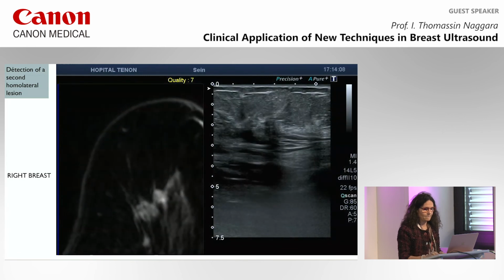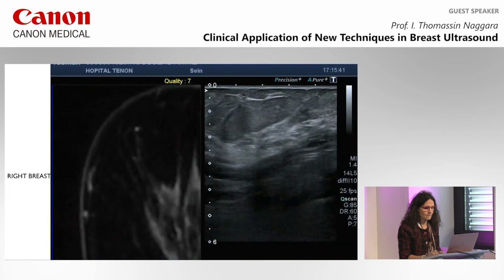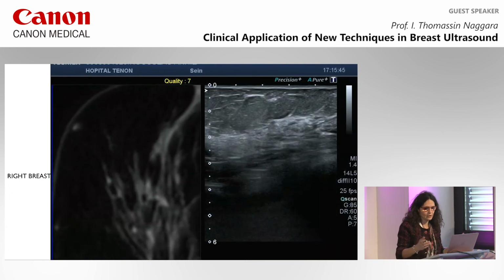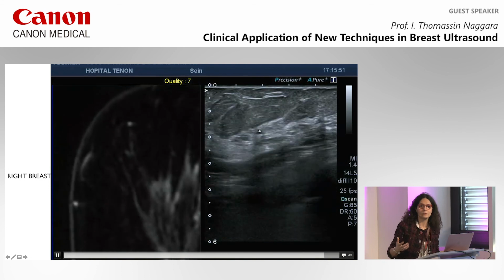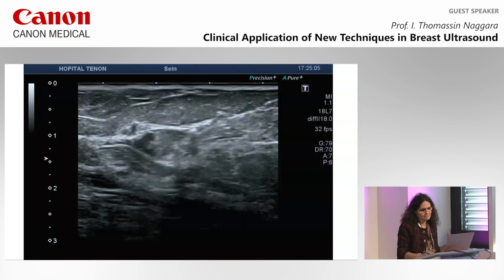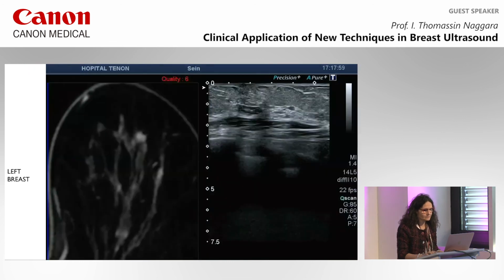Here is another video, it's the same, and we perform the biopsy under fusion. We can perform it with fusion or not. And the lesion, no problem, is there and corresponds to the lesion there. I think usually when you perform a second look, you are not always sure it's the right lesion, but using the fusion, you are more confident. It's our feeling with this new technique.